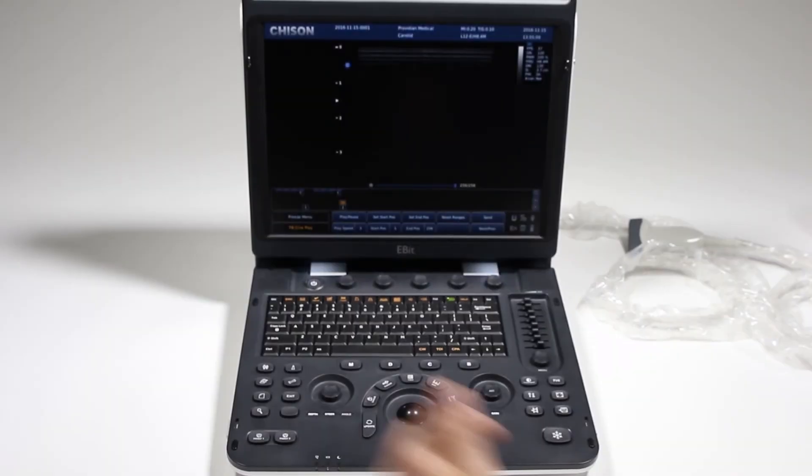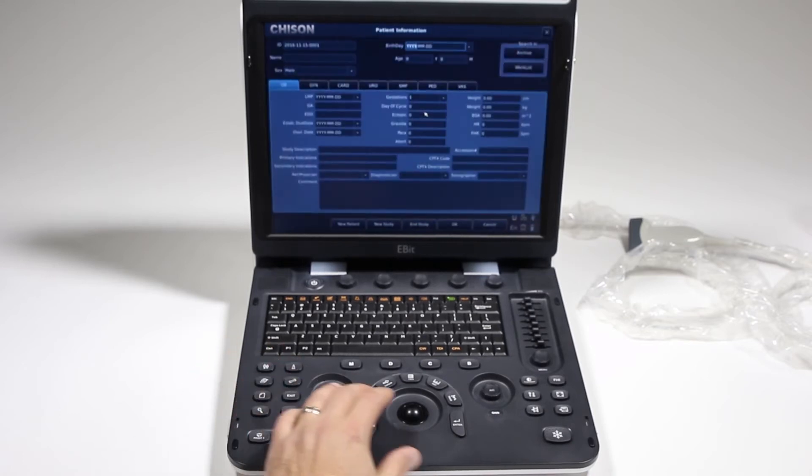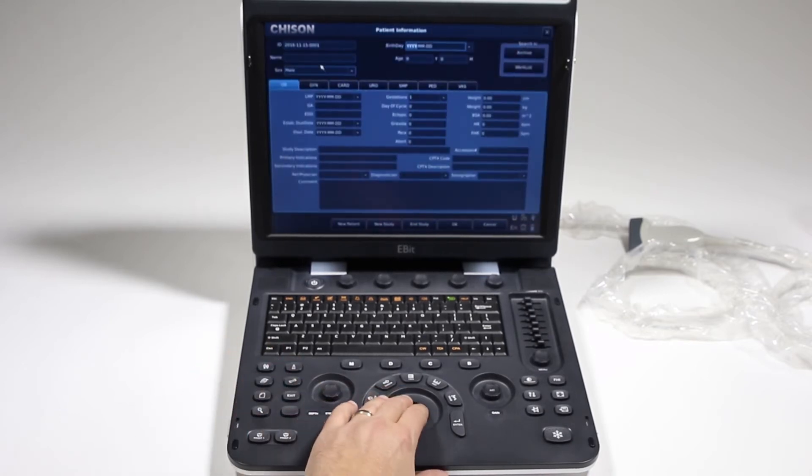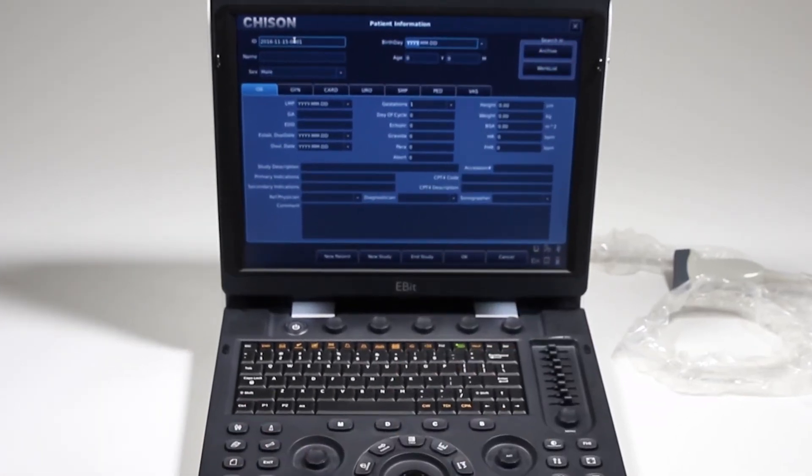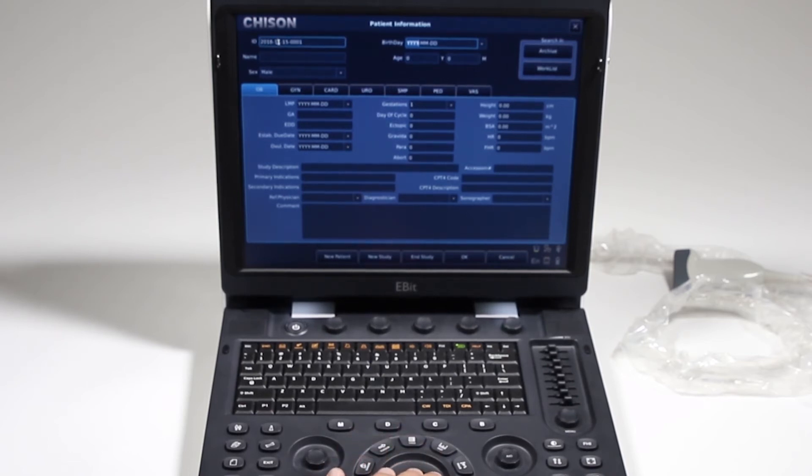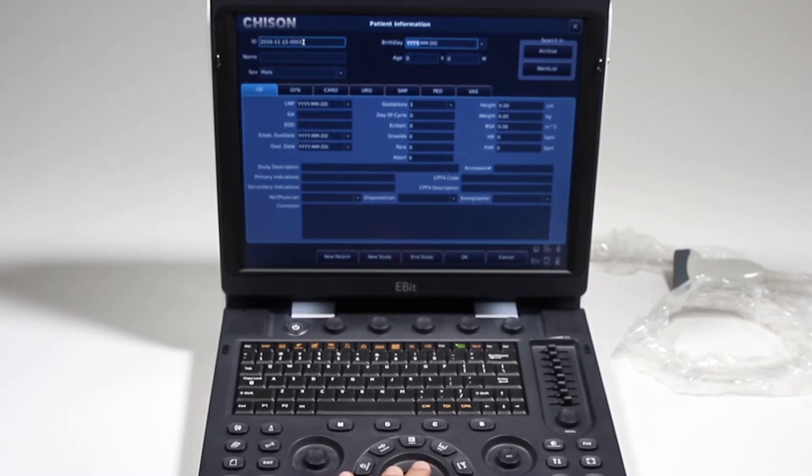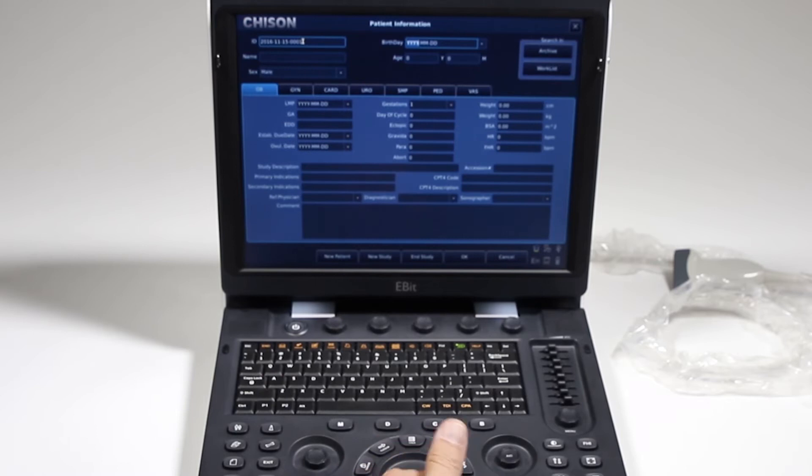To get started in an exam, we'll press the patient key, and here we have our patient information. The ID is automatically assigned. To understand how that is assigned, you have your year, month, day, and then the 001 will be the first patient of that day.